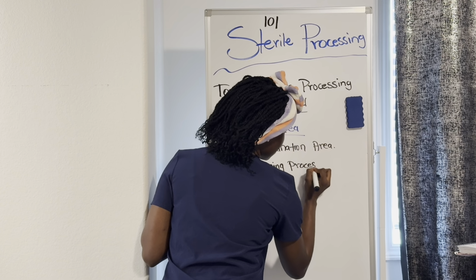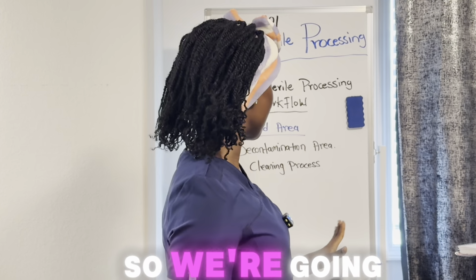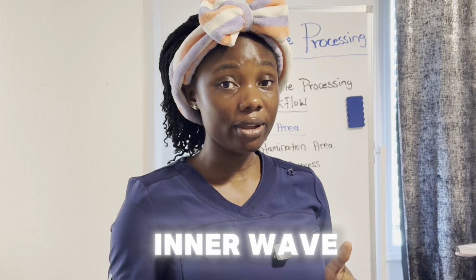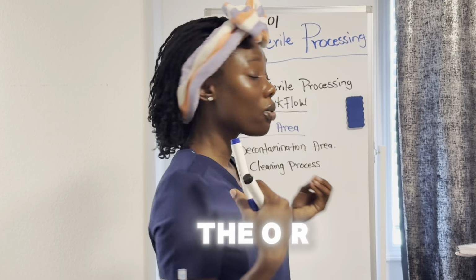During our cleaning process, we make sure to pay attention to each instrument one at a time. So we're going to spray down the instrument. We're going to brush the instrument in the water. We are going to send the instrument through the washer, and after that through the car wash. So if you see decontamination area, just think about the cleaning process. The instrument is being cleaned in the decontamination area after it has been received from the OR.